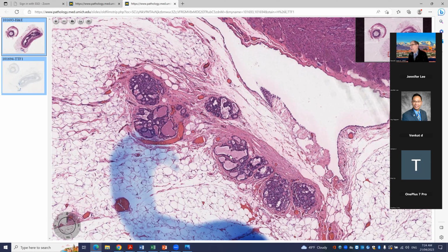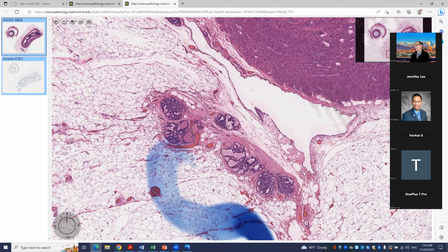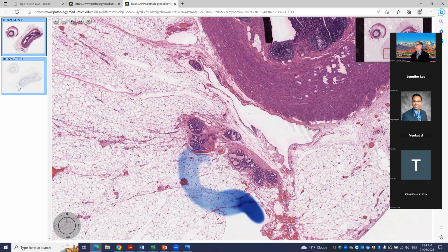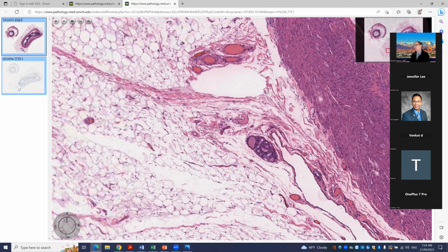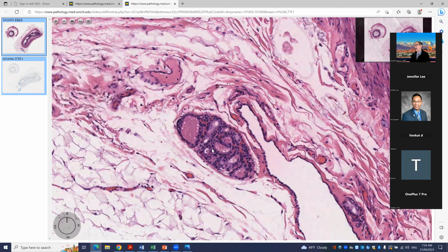So we know that there are times when people have ovarian lesions in the teratoma range that can have peritoneal implants of things like glial tissue and other types of tissue. And so I think what this represents is that this patient actually has a teratoma, maybe with a component of struma ovarii, and that there are associated peritoneal implants related to that lesion.